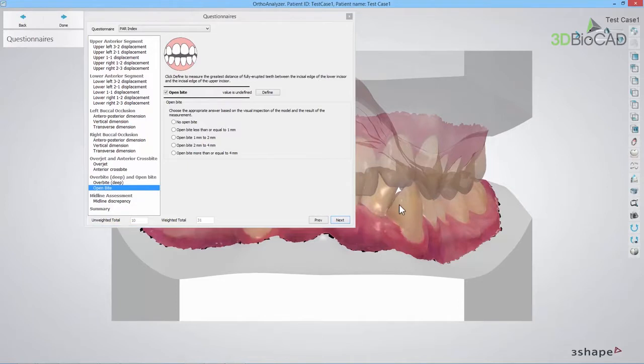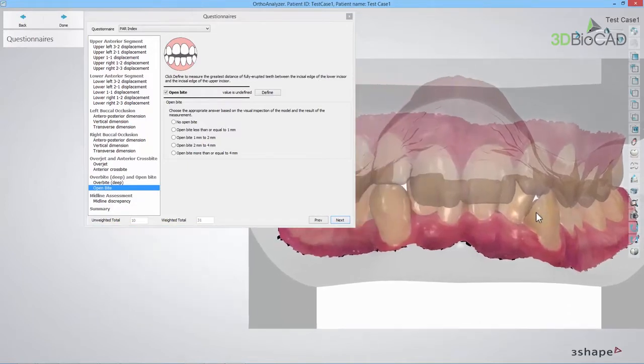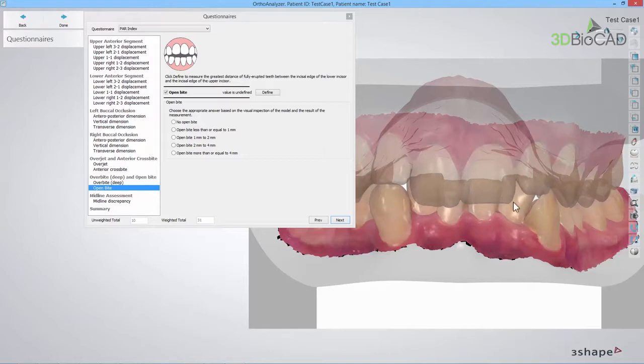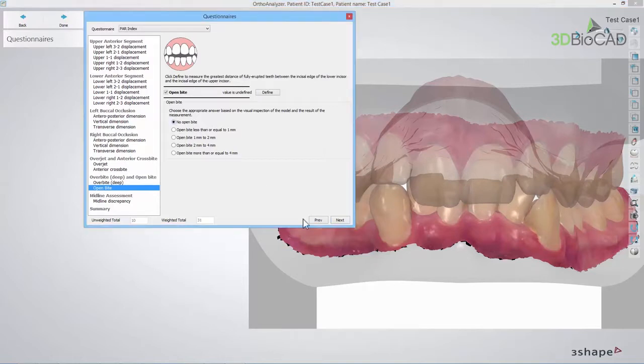The last step is an open bite, where you should click the Define button to measure the greatest distance of fully erupted teeth, if any. Select the appropriate answer according to the measurement result.